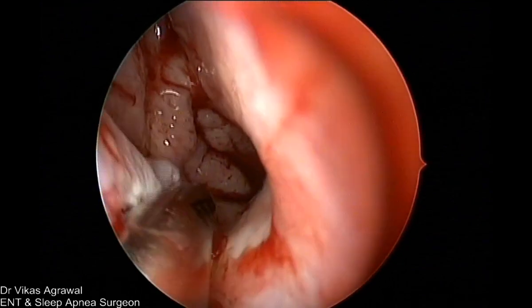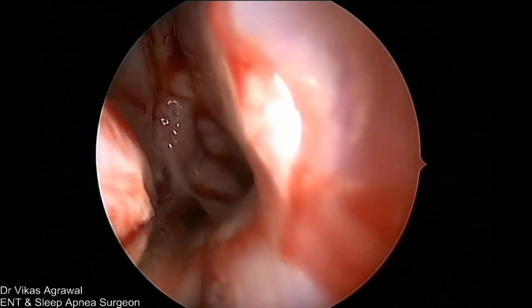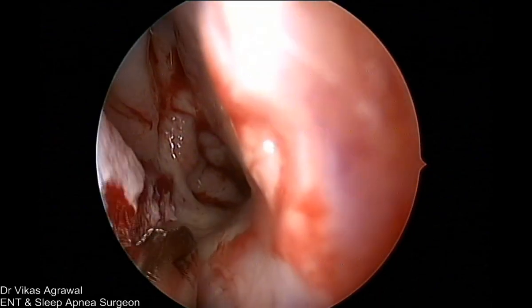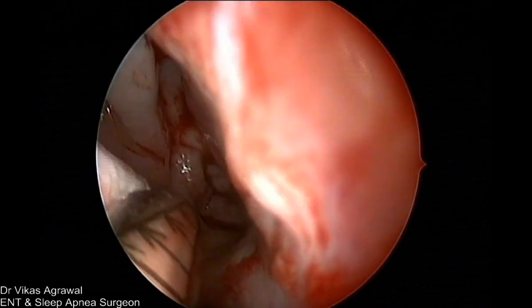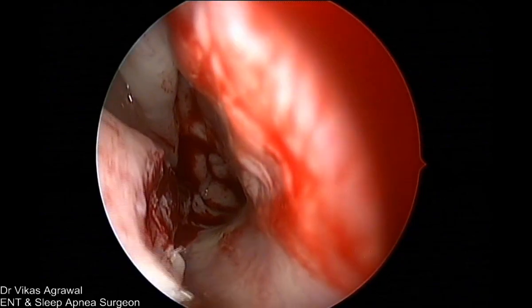I'm just debriding. See, this is all polypoidal. There's no bone into it. Can you see that? And how much is the choana opened? Okay, so I have debrided the posterior part. Then I am debriding the lower part of the entire length.